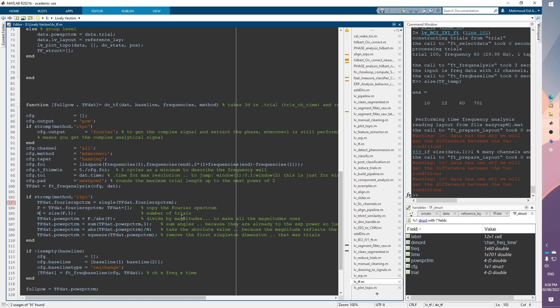I'm accessing the Fourier spectrum, putting it inside f, and checking the number of trials because I'll use this as a normalization factor later. Here I'm taking the complex vectors and dividing each by its own magnitude. This gets rid of all the magnitudes — for example, a vector of magnitude 2 divided by 2 gives magnitude 1.